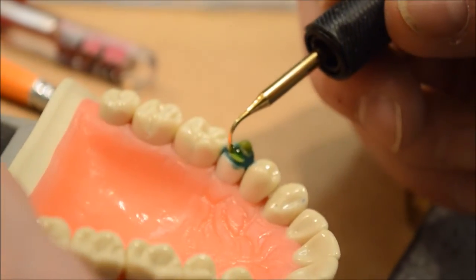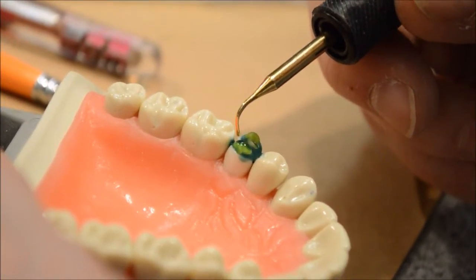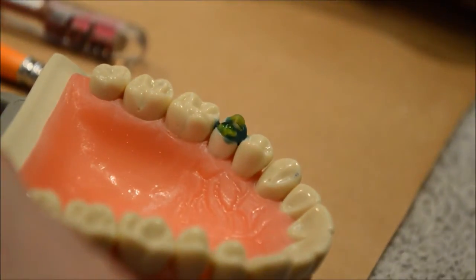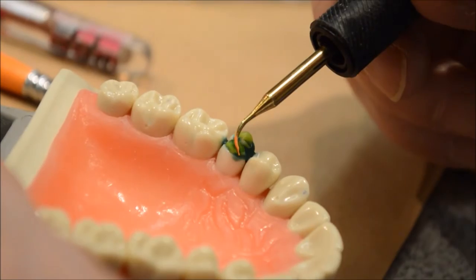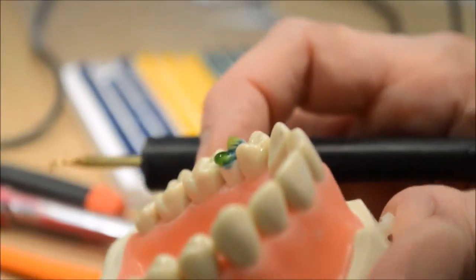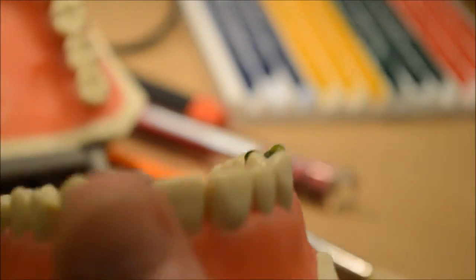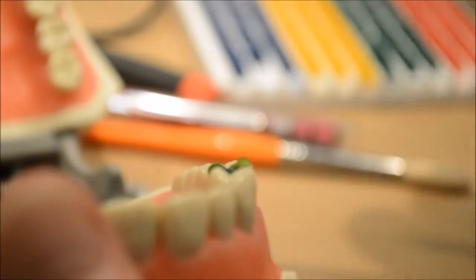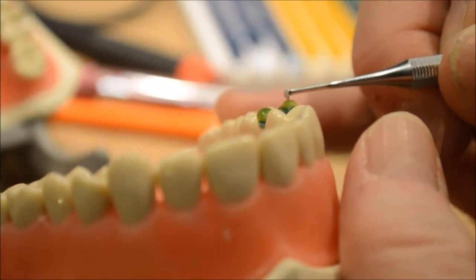The lingual cusp is a supporting cusp, and you will learn that when you get into the waxing class. The supporting cusp is where all the dots and stuff will come from, which I'll show you a little later. Now we've got to look down at this from the mesial and distal and make sure these cusps aren't too high — they should be the same height as this cusp and this cusp. I think we've got it too long right now, so I'm going to cut this down.